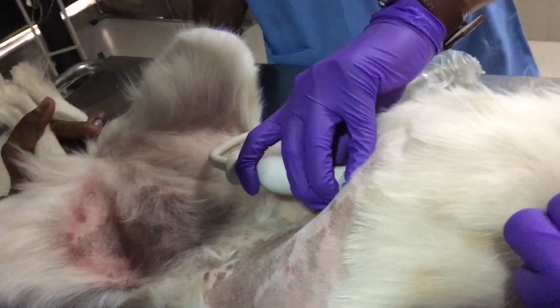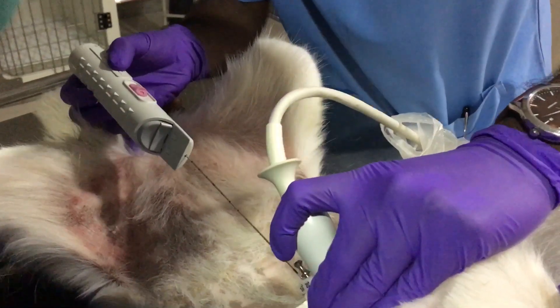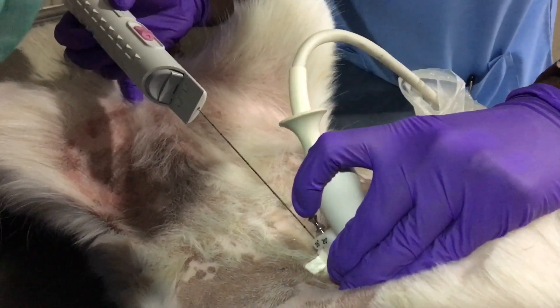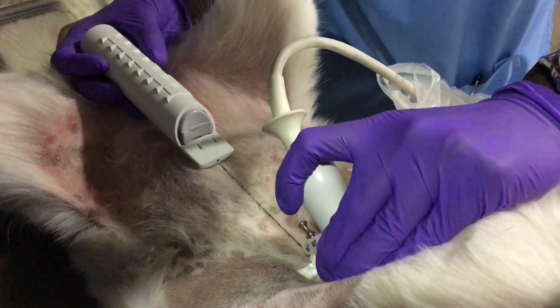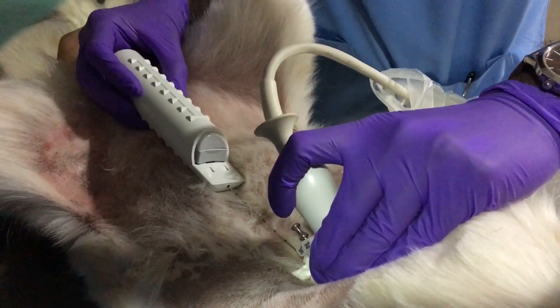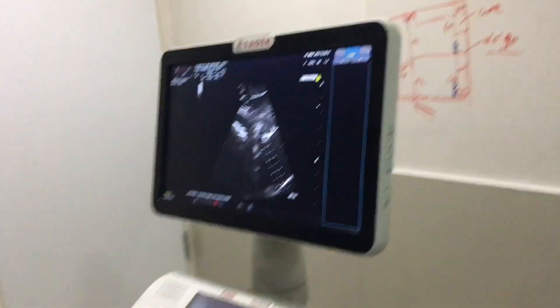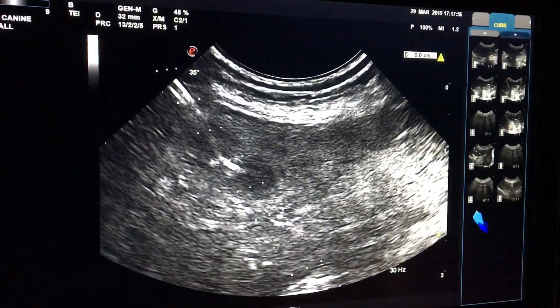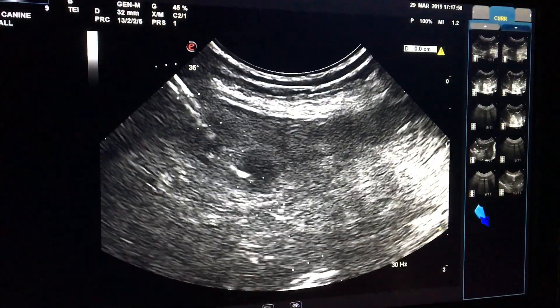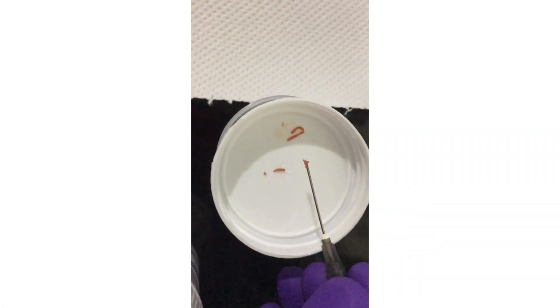The veterinarian is looking for the lesion on the liver. Once the lesion is located, he inserts the biopsy needle into the liver to take a quick biopsy. This can be done two or three times from different locations. As you can see under ultrasonography, the needle is passing through the lesion, and now the needle is withdrawn.